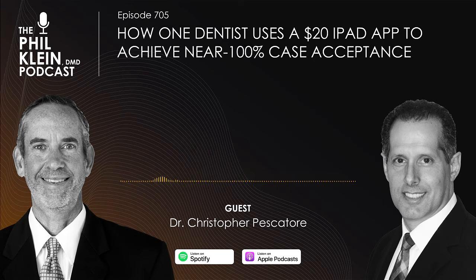So it's really easy. But the problem I find with a lot of the software is that you're making a restoration, so now you have to have a mill. And what about doctors who don't want an in-office CAD/CAM system? What if they want their lab to make their restorations for them, which I think most dentists do? I think this is a great go-between. This is a program that gets you and the patient, or your staff, face-to-face to show them what's possible with this program.